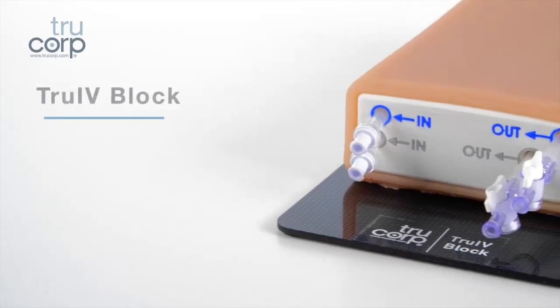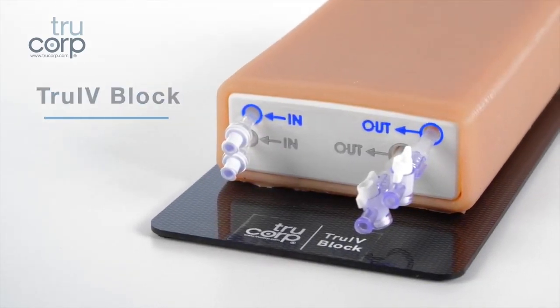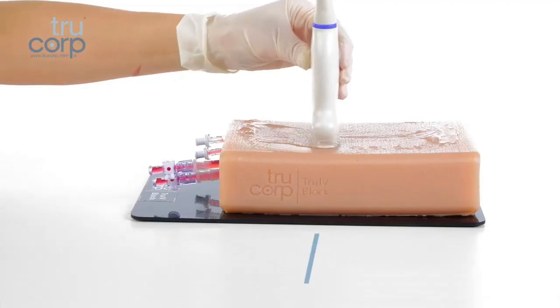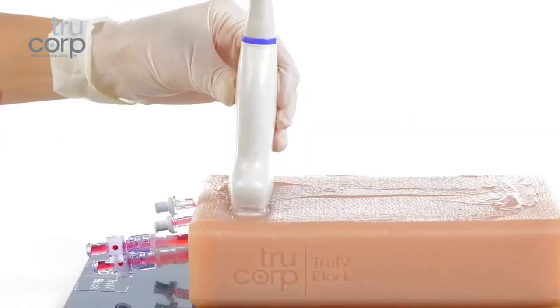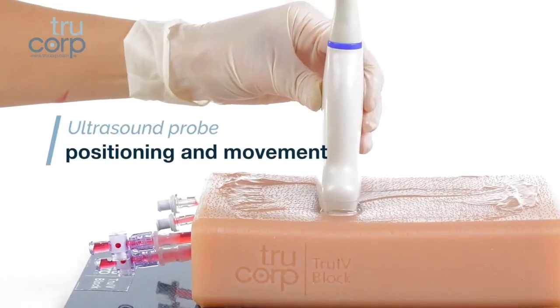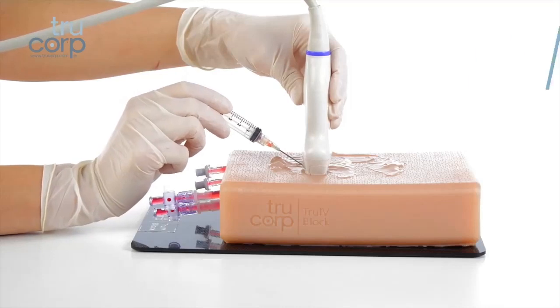The True IV Block is part of the True Ultra range. This model is ideal for practicing the skills associated with ultrasound guided IV cannulation techniques, practicing ultrasound probe positioning and movement, and enabling learners to be proficient at recognizing veins.